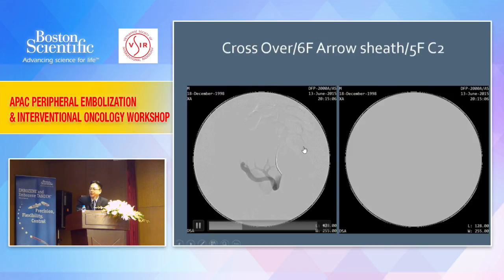Well, you see, when you go more selectively, there are many branches coming out. I know this artery is pretty long. This is the one going to the fistula in the lower pole segment. This is toward the upper half of the kidney, and the lower half of the kidney. There is a big area of renal cortex here. If you use a vascular plug, number one, you would definitely sit along this segment, and your sacrifice of side branches is too severe. The second thing is that for a vascular plug to go through this tortuosity, you not only have to advance your guiding catheter to that level to deploy it, it's also quite risky. You may just dissect the renal artery. So, in my personal opinion, a vascular plug is not a consideration in this situation.